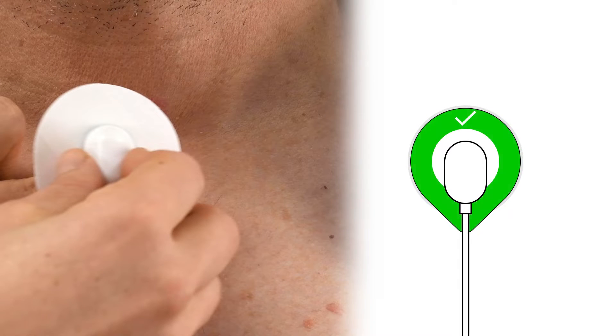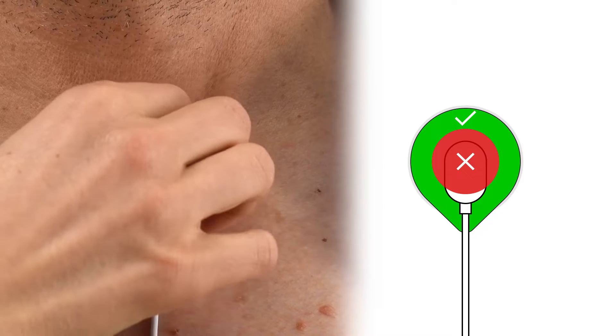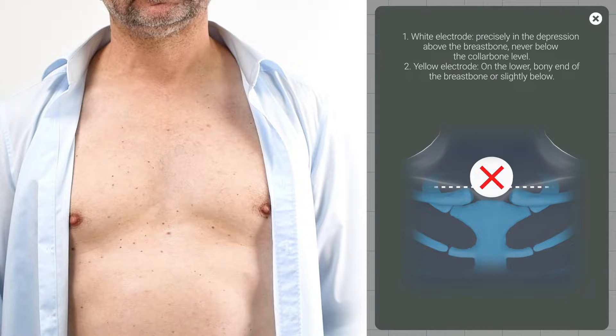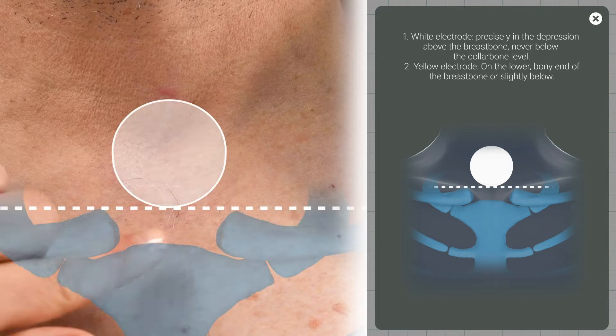When attaching the electrodes, apply pressure only to the adhesive edge. Firstly, position the white electrode precisely in the depression above the breastbone, never below the collarbone level.